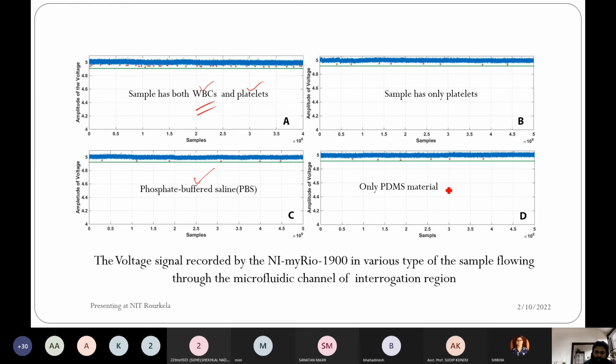So what we conclude is that this is a threshold of less than 1% absorption. Maybe this is due to WBCs or platelets, or just noise of the laser source. We don't know. That is the reason we prepared an upper threshold, so that this kind of unwanted data can be eliminated.